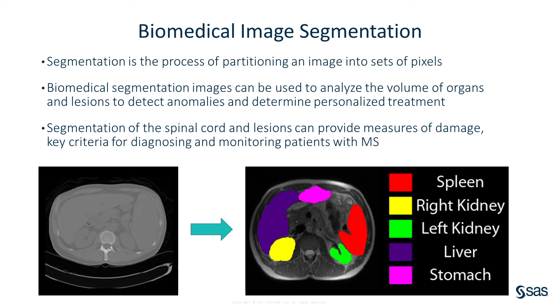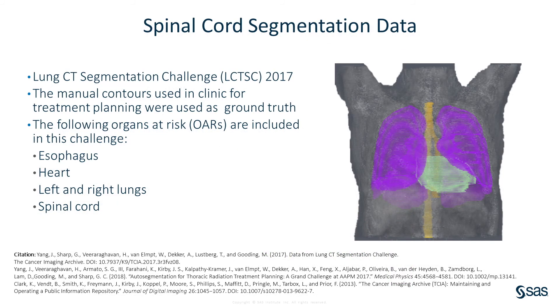In this demo, I'll be showing you an example of automatic biomedical image segmentation using the deep learning, image, and biomed image action sets. This pipeline will read in biomedical image data, train a neural network for spinal cord image segmentation, score a test set, and quantify the results. The data for this demo come from the 2017 Lung CT Segmentation Challenge — a publicly available dataset containing 60 patient images in DICOM format. Along with these images are corresponding DICOM RT files that contain contoured regions of four different organs: the esophagus, heart, left and right lungs, and spinal cord.